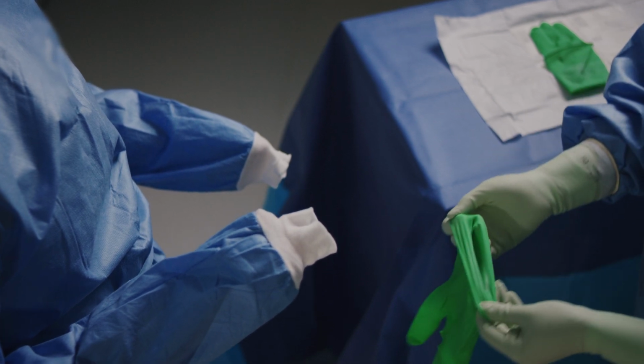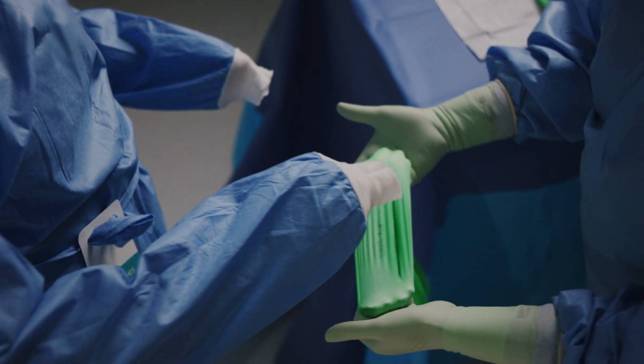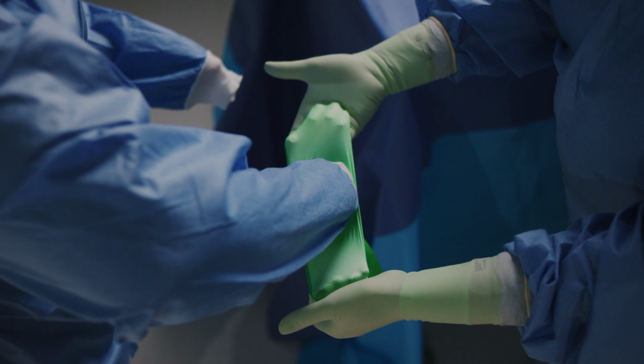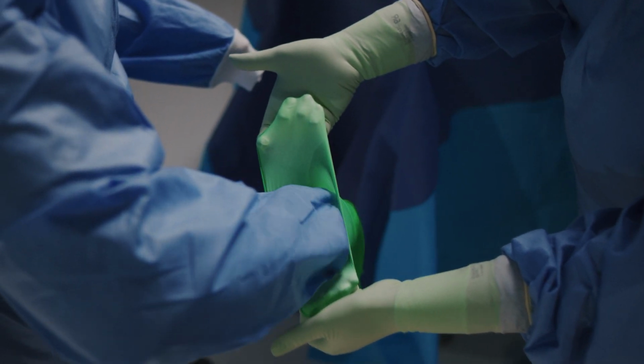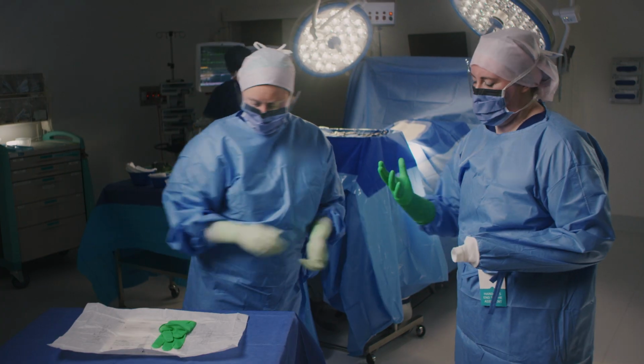Holding at waist level, the glove is stretched open with thumbs extended beneath the glove cuff with the palm of the glove facing the team member. With the cuff covering their hand, the team member then inserts their hand into the glove as the scrub nurse pulls the glove upwards so that the cuff of the glove fully covers the cuff of the gown.